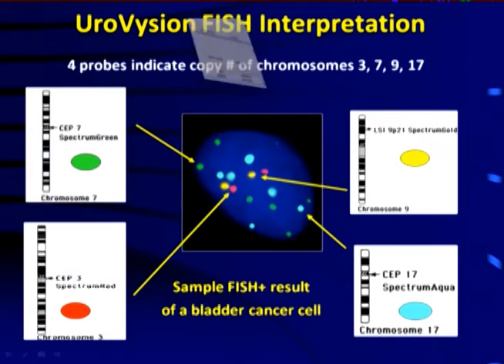What is abnormal? This is an example of a FISH positive result for at least one cell. An abnormality is defined as extra or additional copies. The condition is considered aneuploidy. Extra or additional copies of 2 of these 3 centromeres. That's the minimum criteria. Again, this one has a little bit of nuance to it.